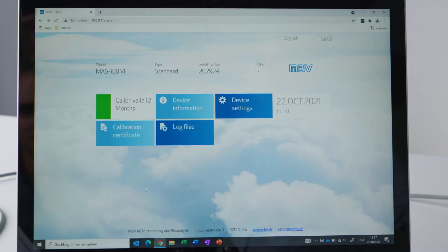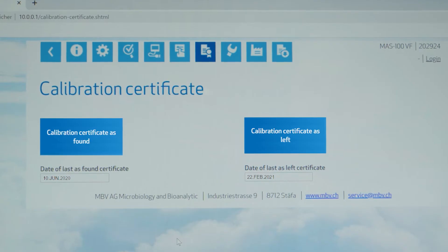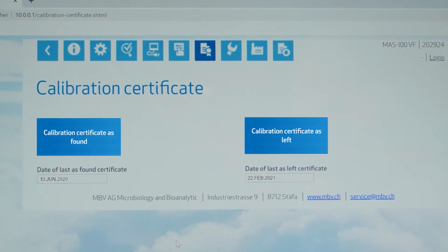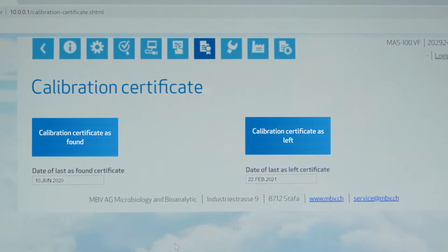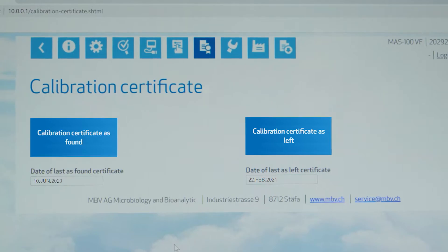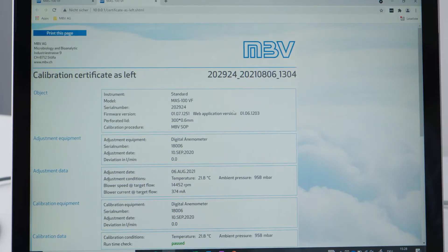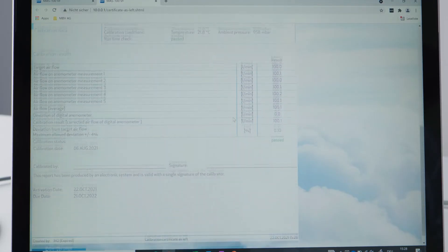There are two points I would like to highlight. First, even if you use your calibration certificate you still have access as it is saved on your instrument. Here in the calibration certificate menu you can access the previous as-found and as-left certificates with all the detailed calibration data. You can save or print them as PDF files.